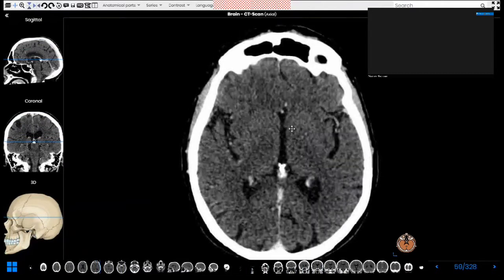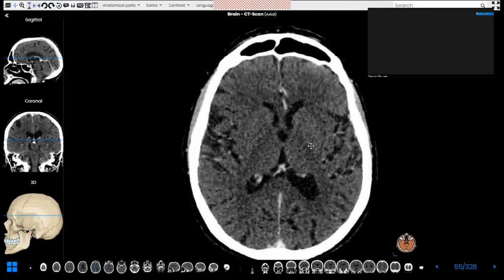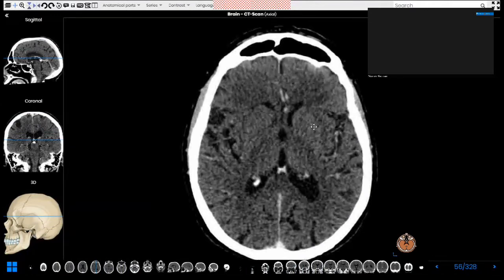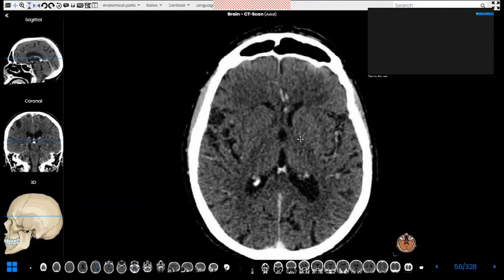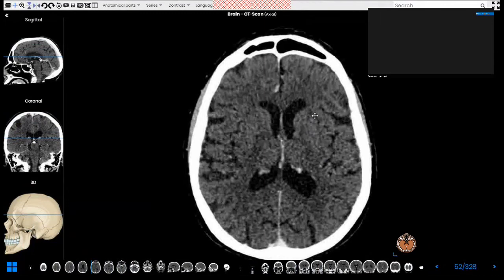Regarding the white matter, there are a few structures you need to know. In this same slice we can identify the internal capsule, which lies between the caudate and the putamen. This is the anterior limb of the internal capsule, this is the genu of the internal capsule, and this is the posterior limb of the internal capsule. This lateral linear structure lateral to the putamen or basal ganglia is called the external capsule.